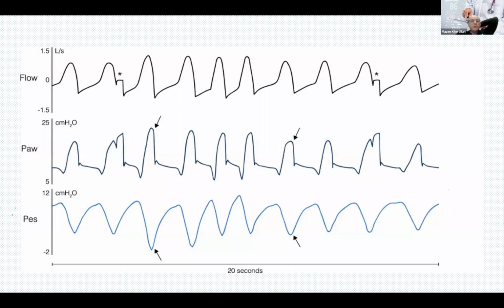And those are the pauses that I was telling you about. Every few breaths, there will be a pause. The purpose of this is to measure the peak pressure and the plateau pressure. And this way, we would know exactly what is, this is the flow I was pointing to. This is the pressure, peak pressure, and the plateau pressure. In this one, you can see the plateau here is higher than the peak.